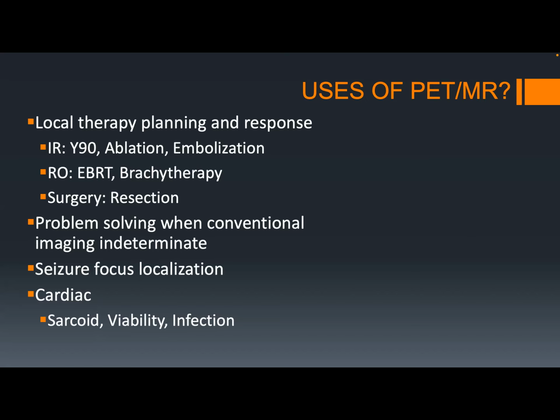We have done a small amount of seizure focused localization. That has been some kind of strange logistical issues to finally get that started, but we are doing it. And then other places, not quite us, although we are building this protocol right now, is working on cardiac indications, which at the beginning will probably be for sarcoid viability and possibly infection.